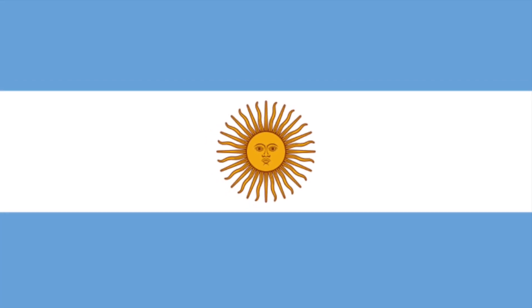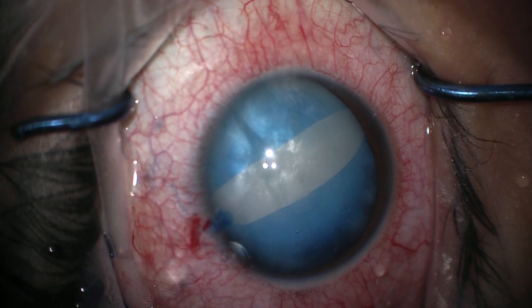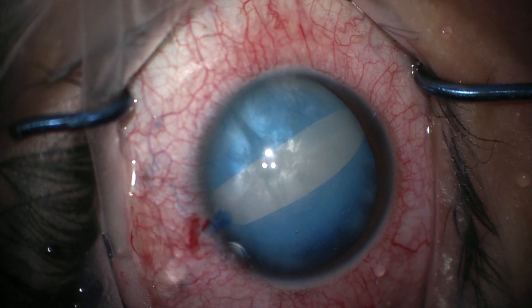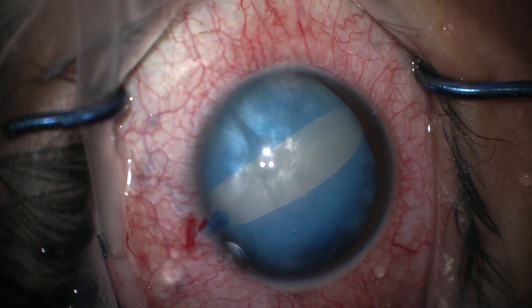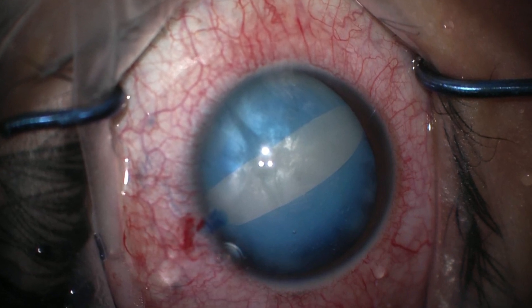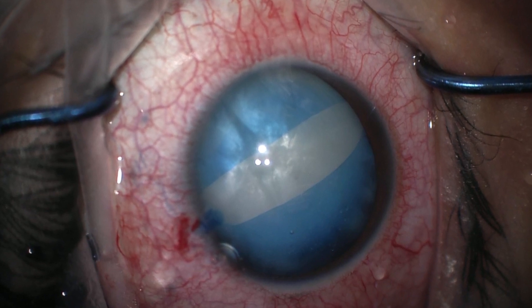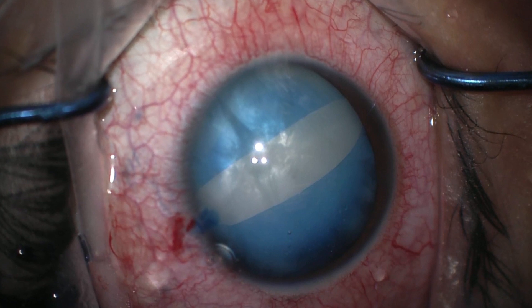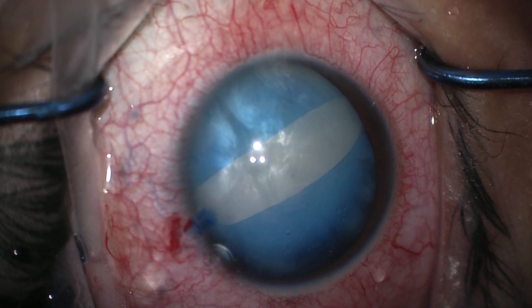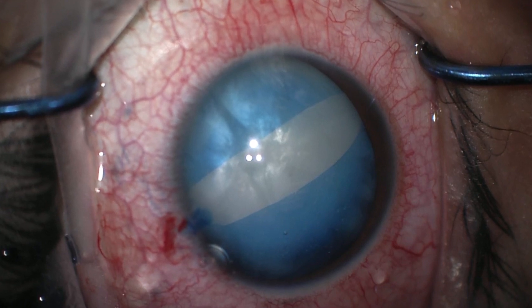The Argentinian flag sign is a biradial capsular tear that occurs after dying the anterior capsule blue. It most commonly occurs in intumescent pearly white cataracts with slight hyperhydration of the lens fibers. These hydrated lens fibers create anterior and posterior pressures within the capsule, separated by equatorial cortex that hasn't yet liquefied, meaning the cortex is still in contact with the capsule.